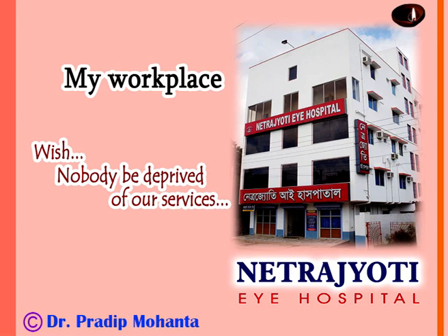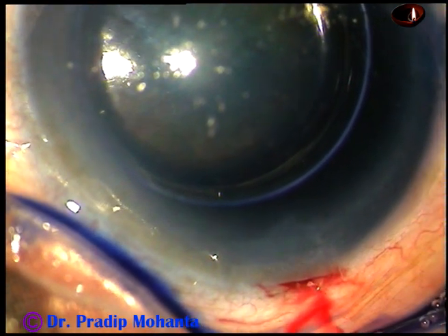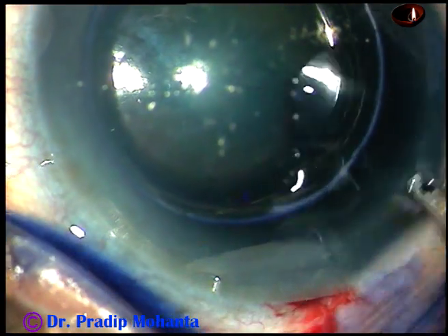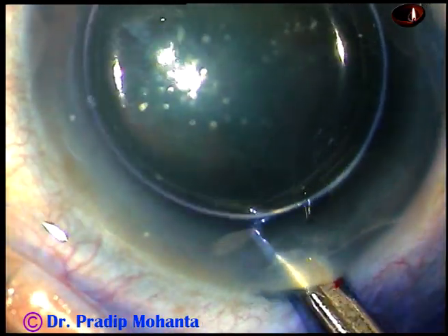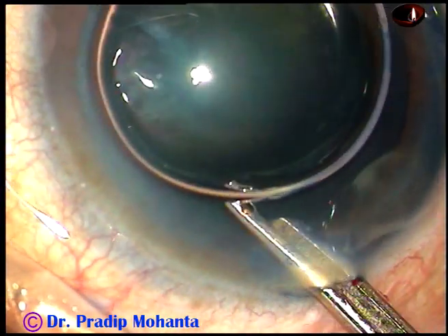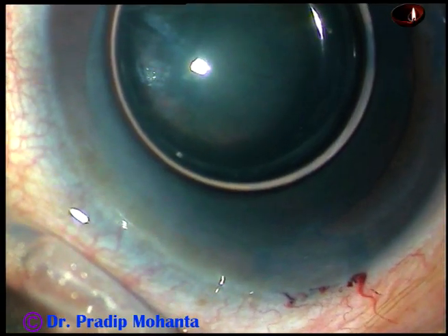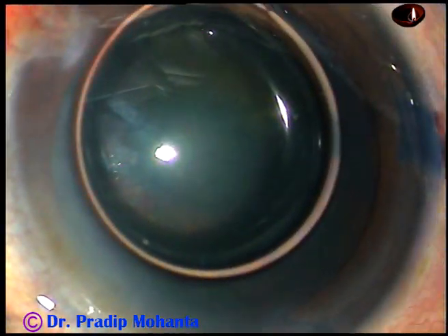Friends, welcome to my hospital at Ranaghat, West Bengal, India. This is phacoemulsification of a cataract with grade 2 plus nucleus sclerosis. In this video I want to show the ABC of phacoemulsification — that is, the divide and conquer technique of phacoemulsification. This is a very safe technique for beginners.